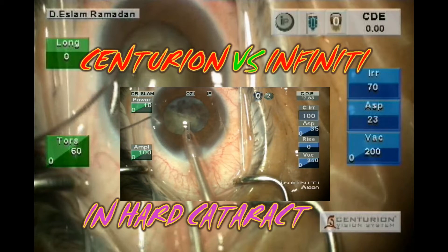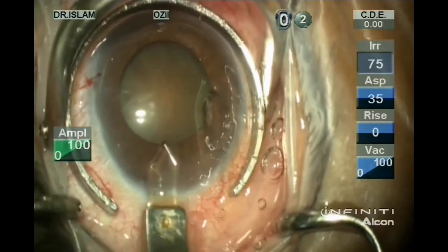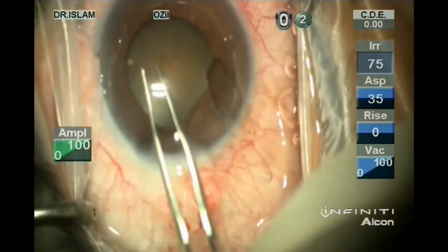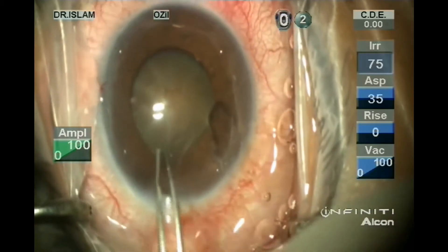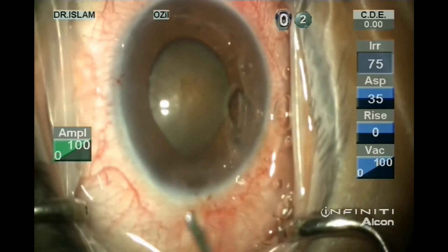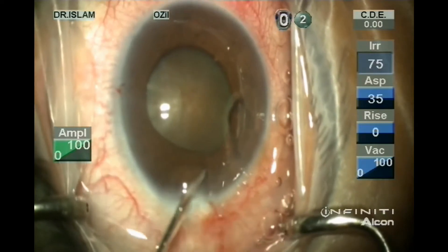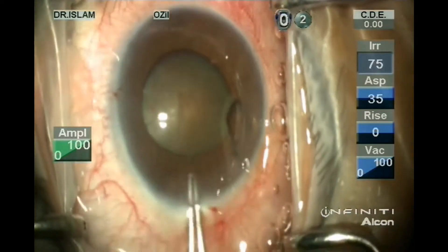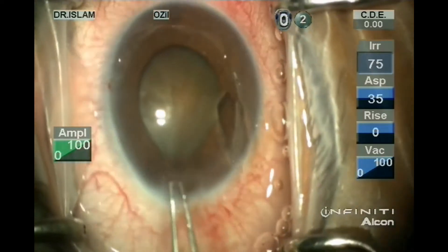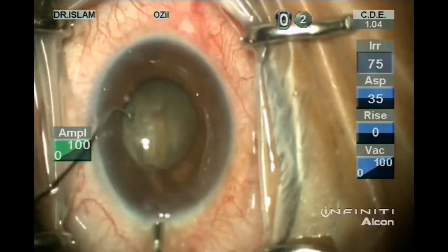Centurion versus Infinity in hard cataract. This is a video presentation to compare between the two machines, the Centurion machine and the Infinity machine. This is done in the same patient with the same density of cataract by transferring the video overlay between the two machines and splitting each step into two parts using each machine.